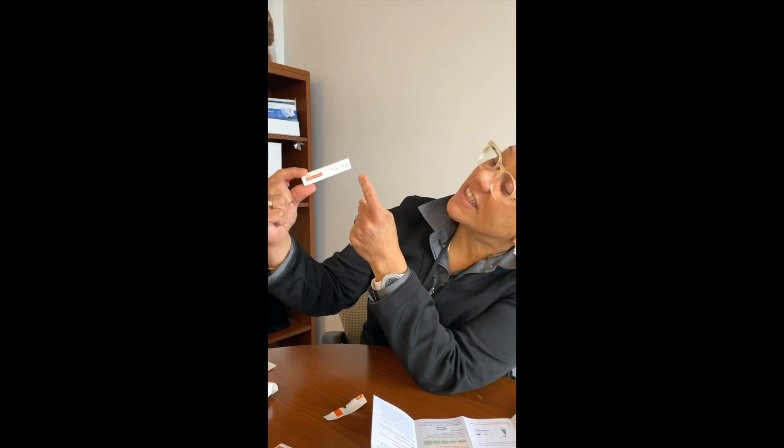Now I'm going to prepare my test card. I'll open it and pull it up. The instructions say to twist open the small white cap of the tube and add three drops of the sample — the liquid that now contains the material from inside your nose. The test card has a section that says 'three drops.' I'm going to put three drops right there. Here we go: one, two, three. That's it.